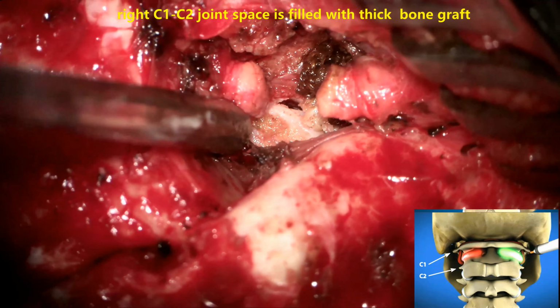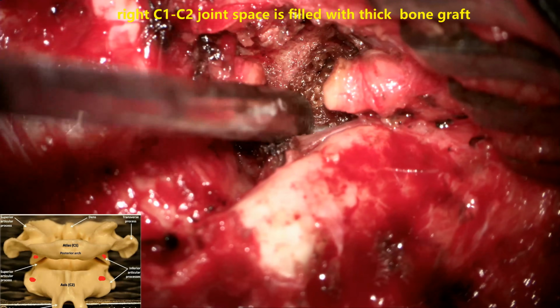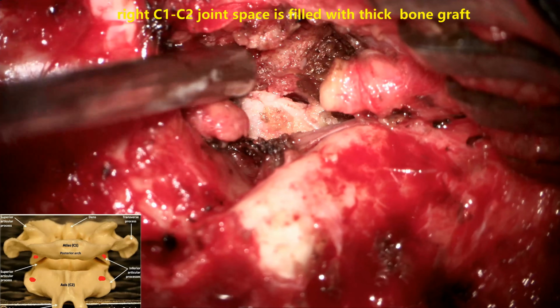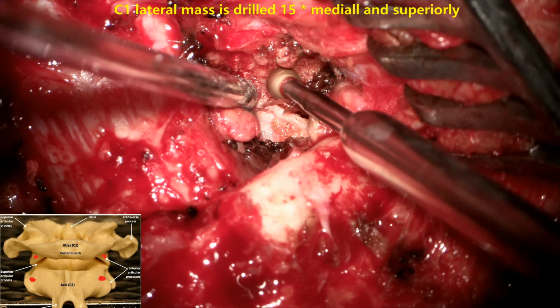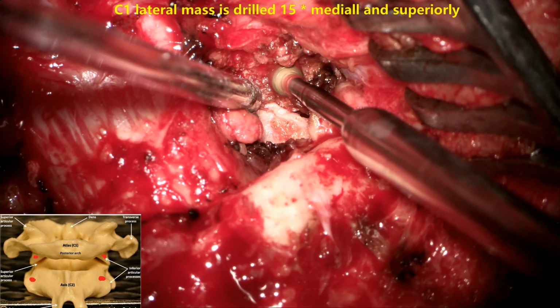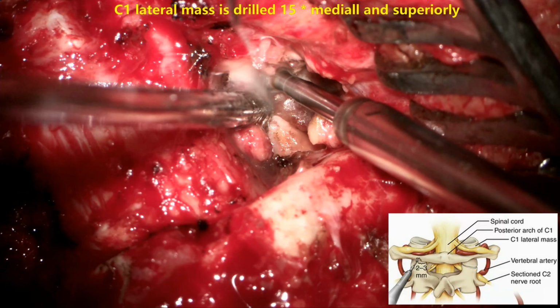Some authors use spacers, but we prefer to use the bone graft, which is more helpful in causing the fusion subsequently and an immobile fusion.